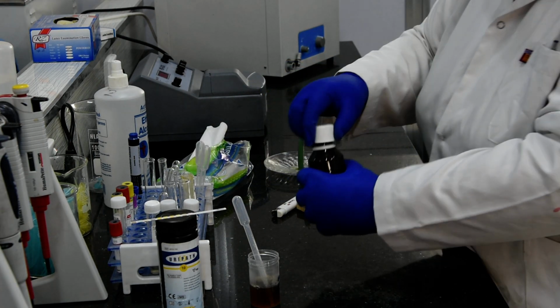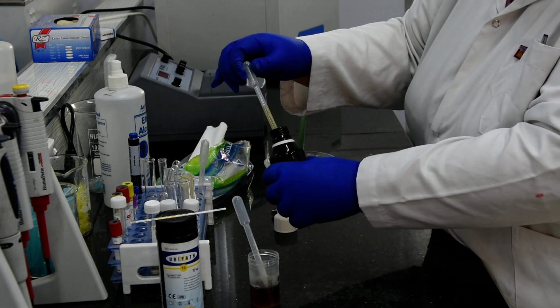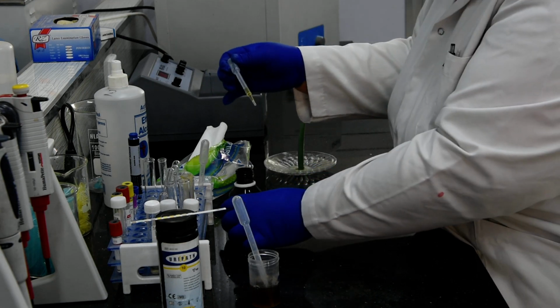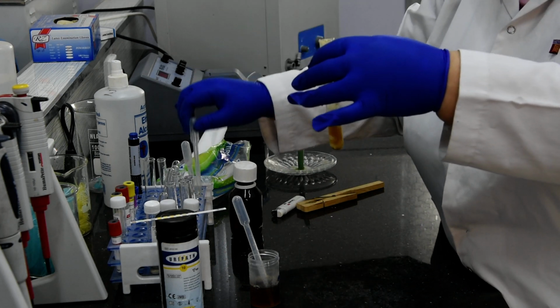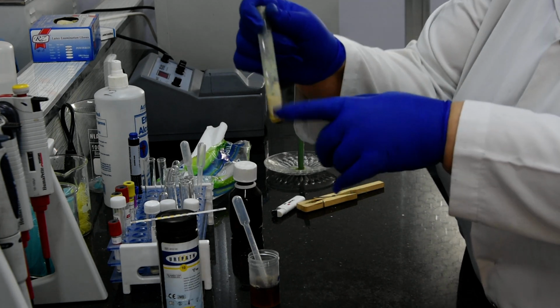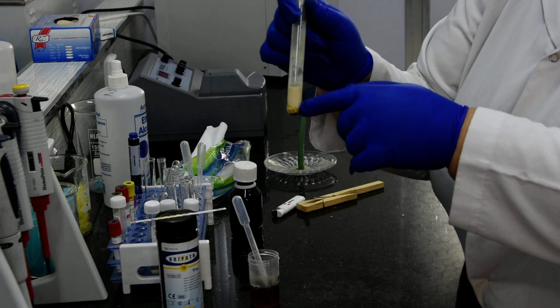To distinguish between phosphate and protein, we will take 1 drop of glacial acetic acid, but beware, it's very corrosive. You will see, after 1 drop of glacial acetic acid, the turbidity or cloudiness is staying, not disappearing. That means we have protein.